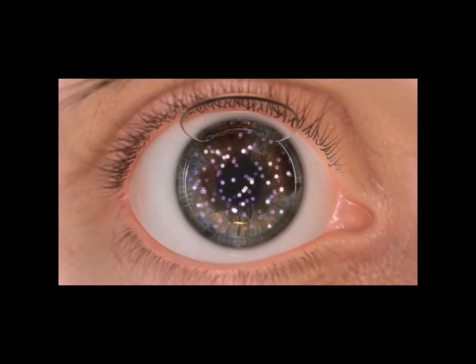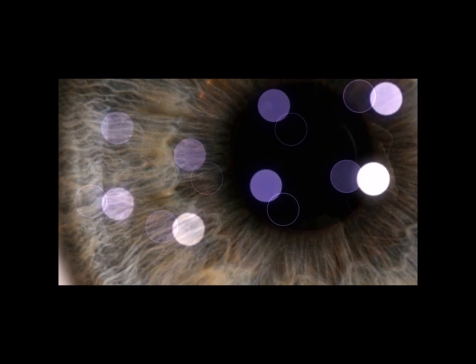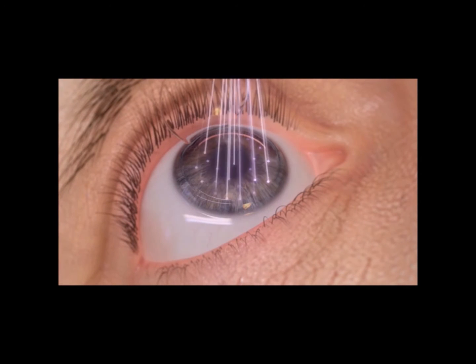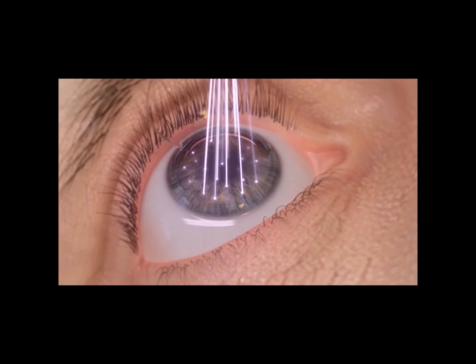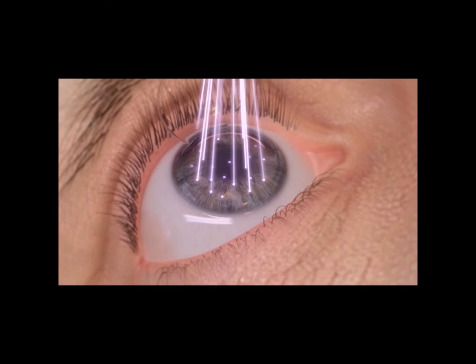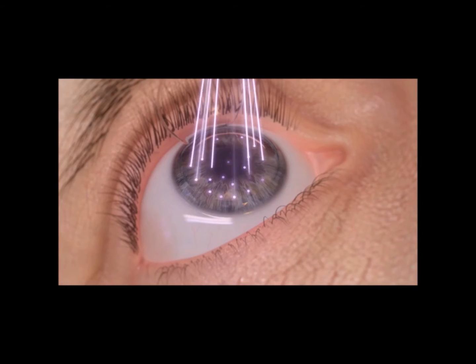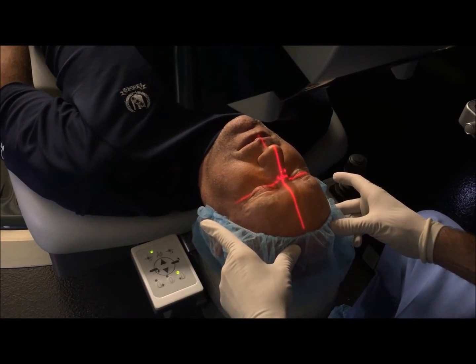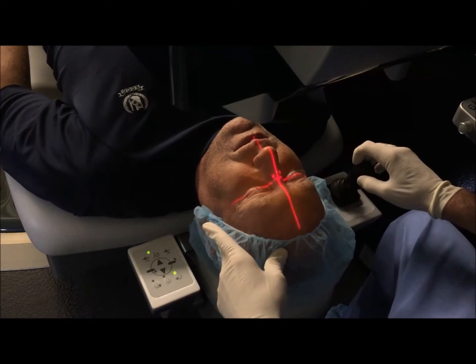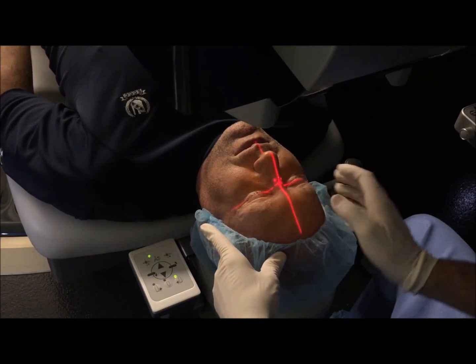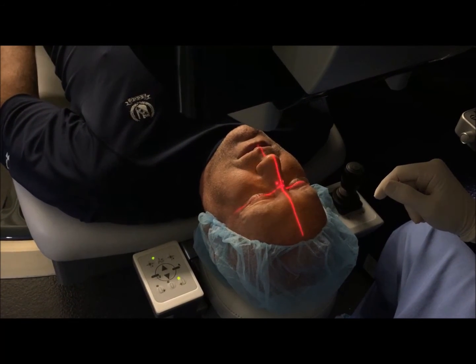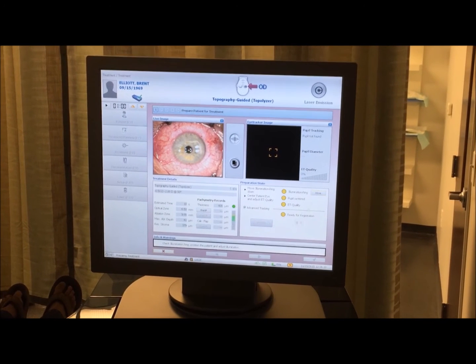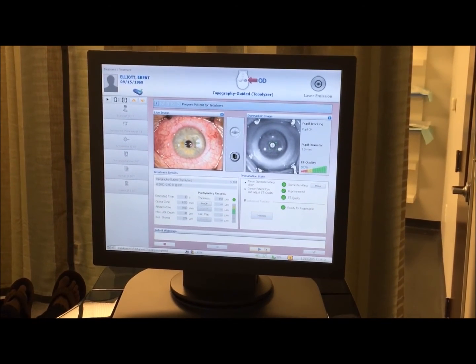With the WaveLight excimer laser, the spot size is small and the variable spot will fire — and if it thinks the eye is not in the right position it won't fire, and will come back and fire that spot later. That's why if you have a patient with poor fixation you can hear the laser sputtering. You can stop and start if needed. I like to use fiducials both vertically and horizontally to line the patient up perfectly. Once in gross alignment, I activate registration during the treatment for perfect alignment for astigmatic and spherical treatments, as well as the topographic treatments.